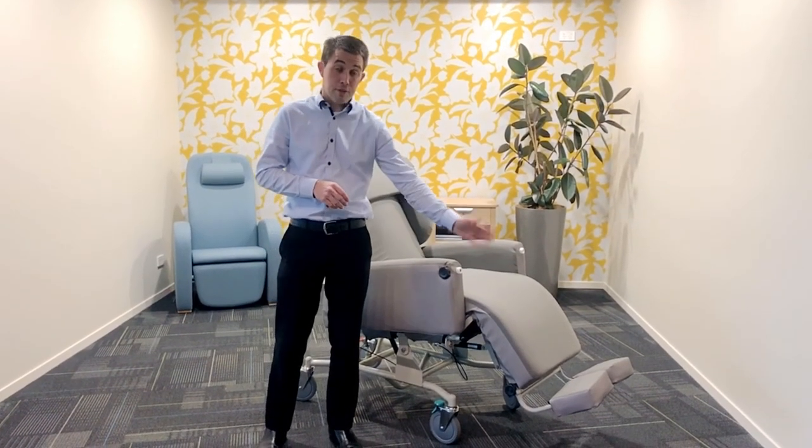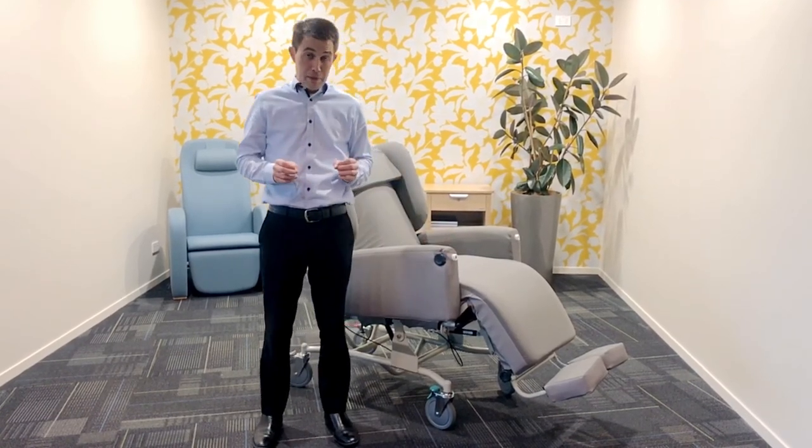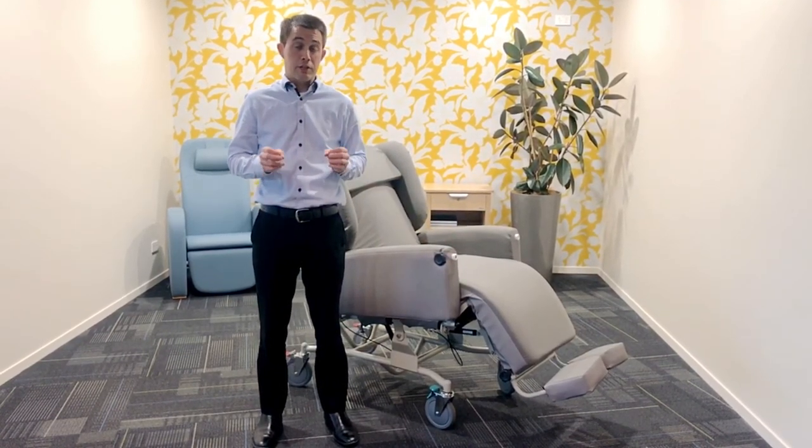This chair comes complete with the footrest and with a tray, and there are many other benefits we would love to show you. So please give us a call.